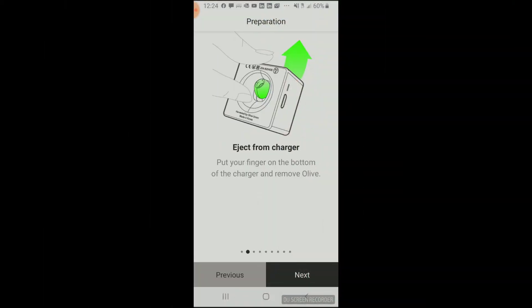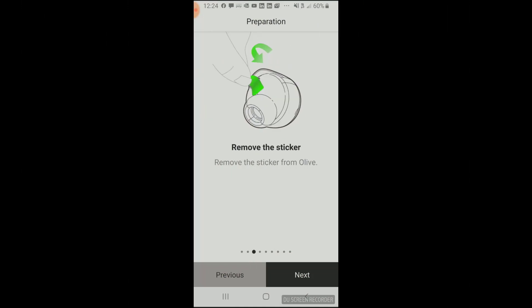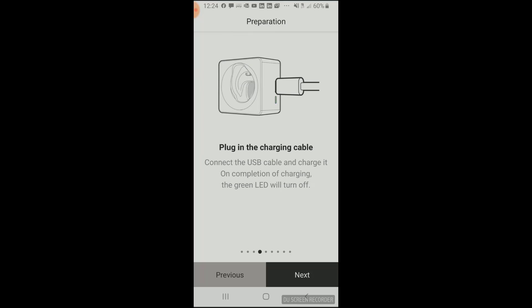Olive did a really nice job with their app, providing step-by-step instructions on how to set up their device. This process starts by removing the device from the charger, which is actually kind of a pain — when you have it inside the charging case, you can't grab it out from the top. You actually have to lift the charger and push it up from the bottom just to pop it out. Once you have it out, you need to remove the shipping sticker, plug the charger in with the USB cable, and charge the earbud.